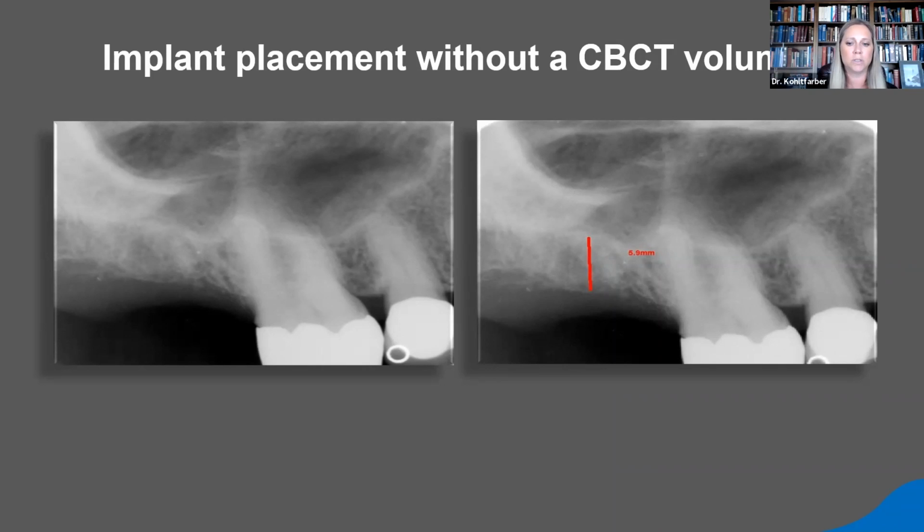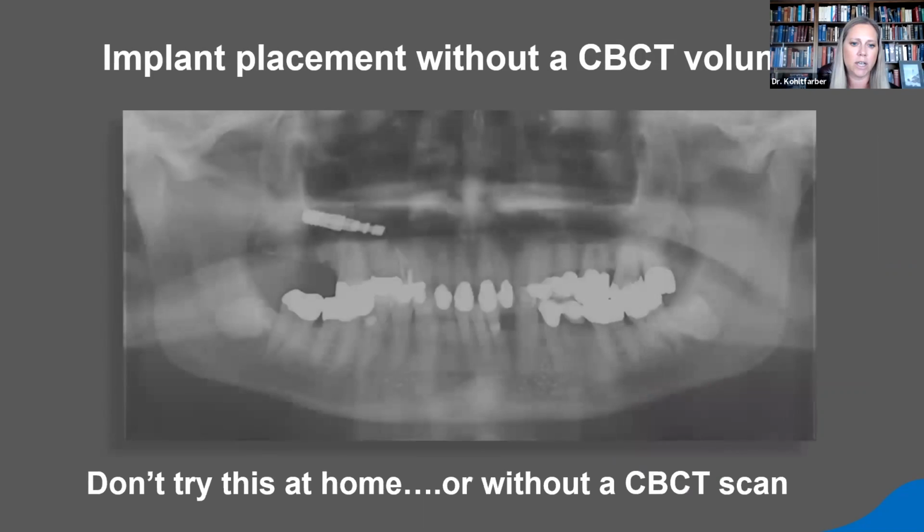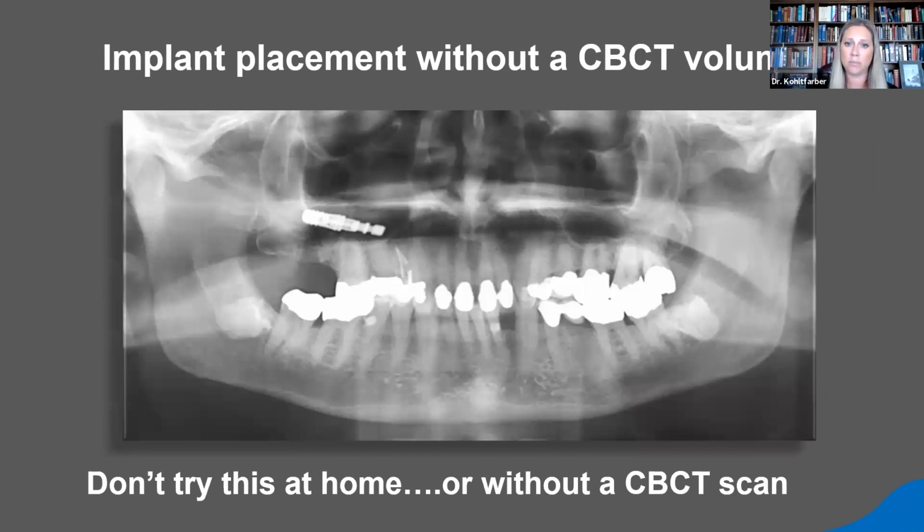Unfortunately, this individual did go ahead and measure the amount of bone that they thought was there from the angled posterior maxillary PAs. Came running down to radiology, and the complaint was, I lost the implant. And guess what? We found the implant. In fact, the implant looks just as shocked as we do. So obviously, this is a really bad day for the patient.